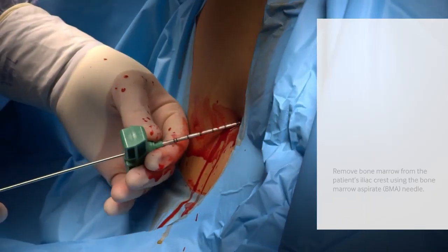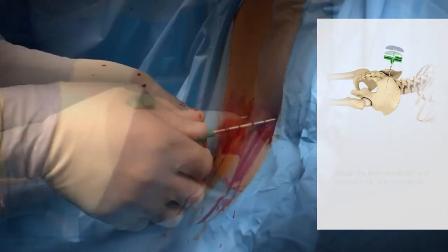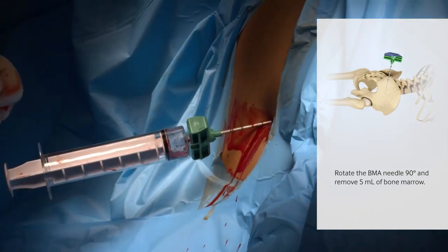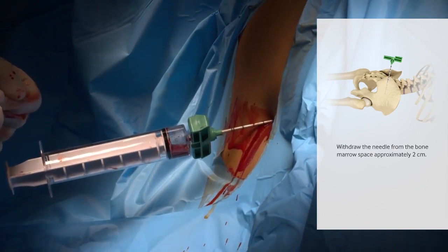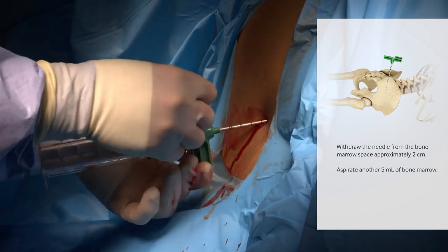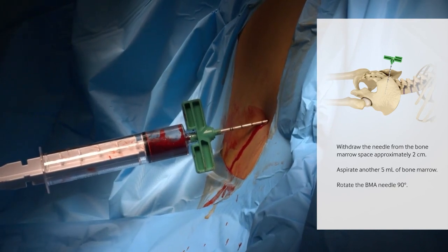Remove bone marrow from the patient's iliac crest using the bone marrow aspirate needle. Rotate the BMA needle 90 degrees and remove 5 milliliters of bone marrow. Withdraw the needle from the bone marrow space approximately 2 centimeters. Aspirate another 5 milliliters of bone marrow, then rotate the BMA needle 90 degrees.